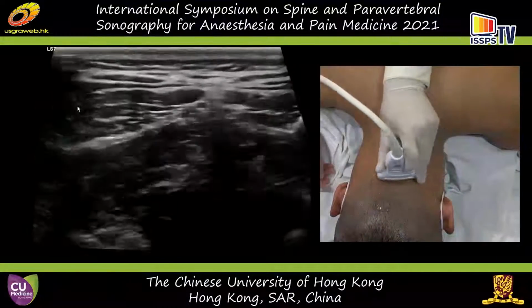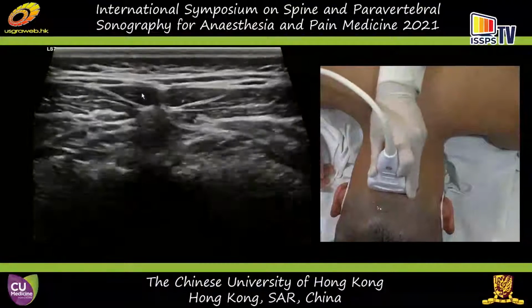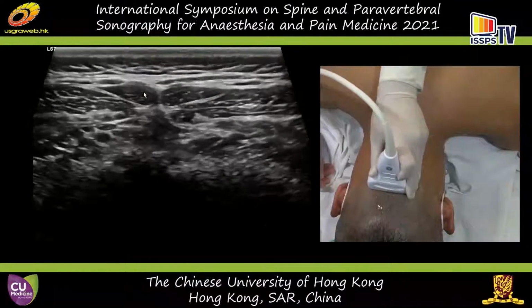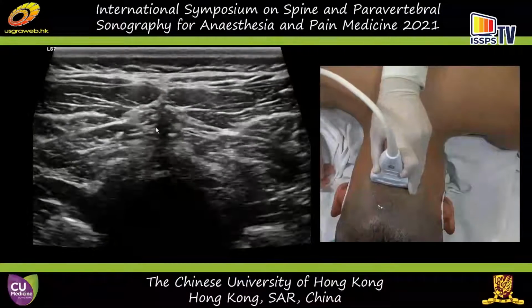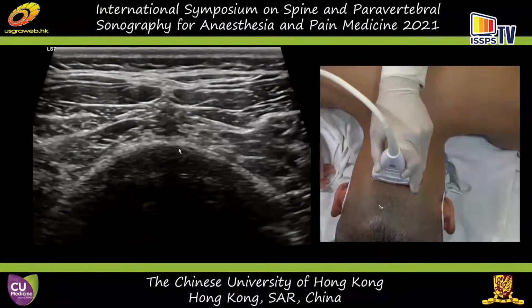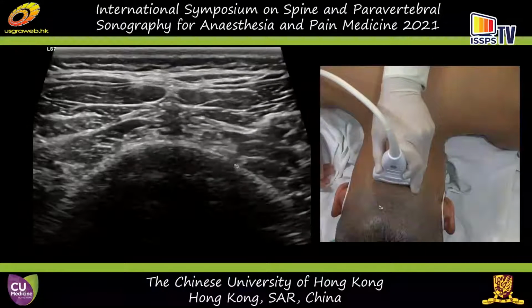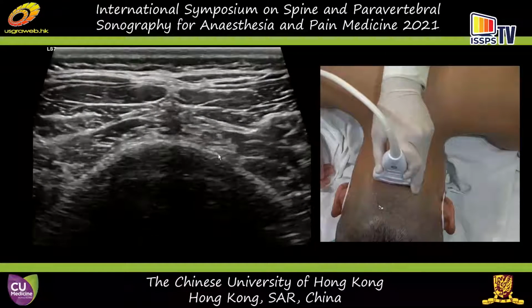Then we're back to the midline here, and we go to the occiput again. Then we go caudal. This time you're going to pay attention. The first bony landmark you're going to see is not a process, but a ridge. So this is the ridge of C1, the whole part of C1.